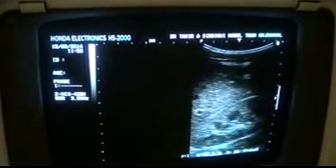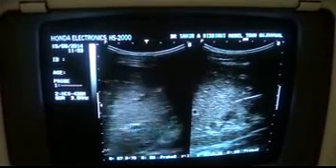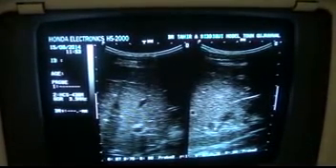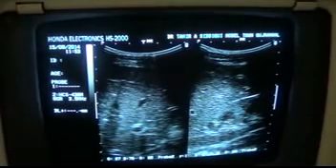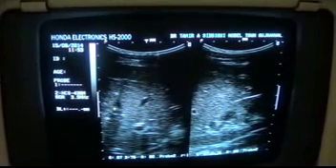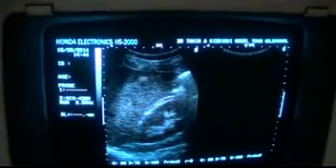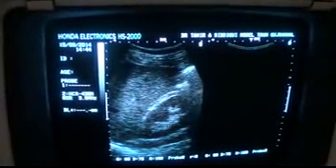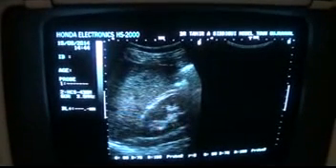Now take this kidney on the right side, freeze, go to the liver, and you can very well make out that the echogenicity of the renal parenchyma is raised compared to that of the normal liver. So this is one point to remember out of many. Thank you very much. On the left side of the screen, you are seeing a liver. This is a normal liver, in fact, and this is the kidney in longitudinal section, the right kidney, and both the liver and the kidney are normal.